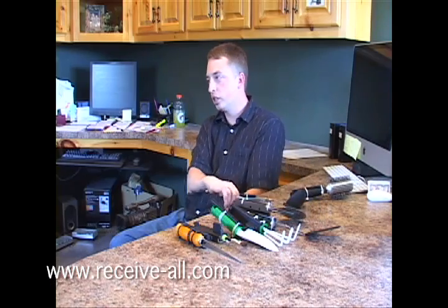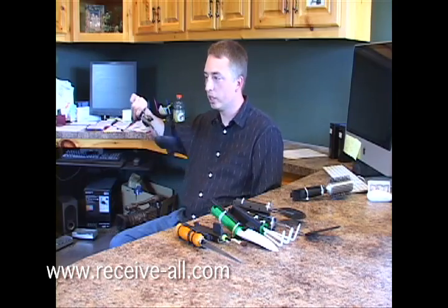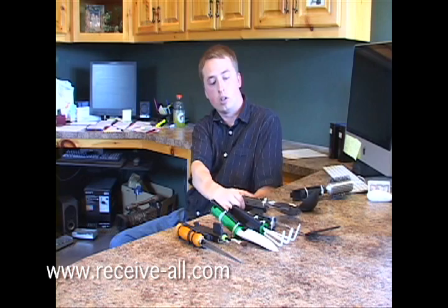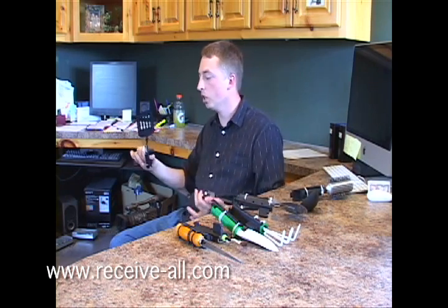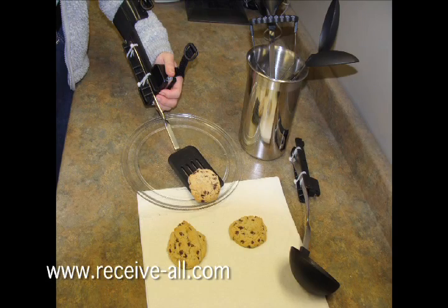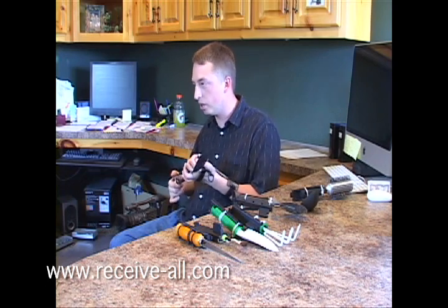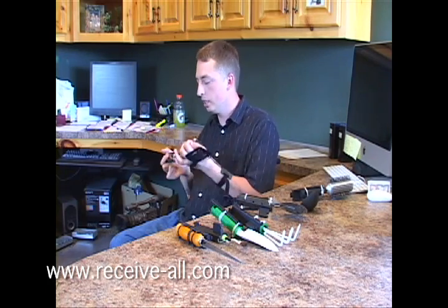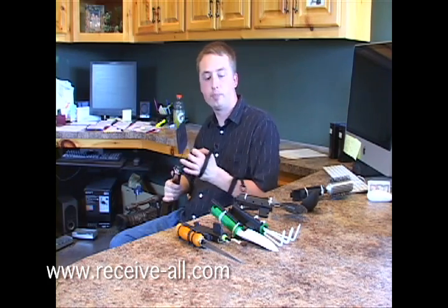Other things in the kitchen, for somebody who would have trouble holding a ladle, or a pizza cutter, or a spatula even. All these items can be placed in the adapters. We got creative with this one with a flat steel handle that we're able to twist, so it was at the right angle, and it was really held into the adapter wall.